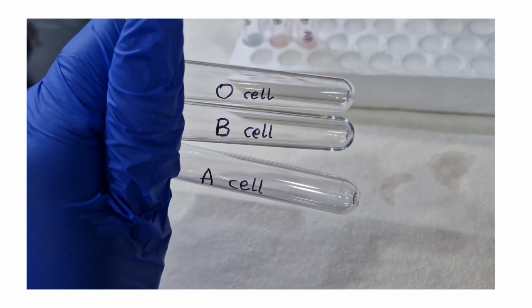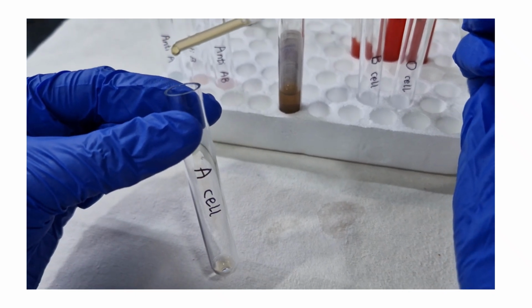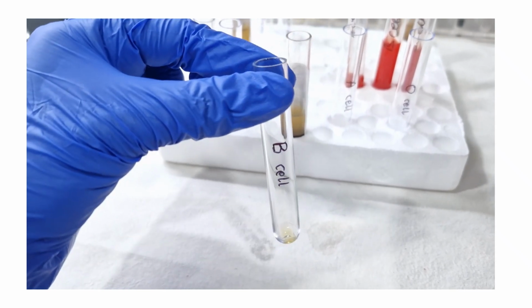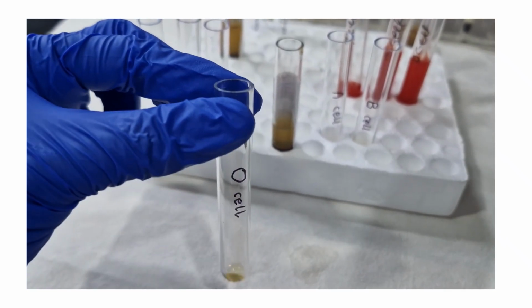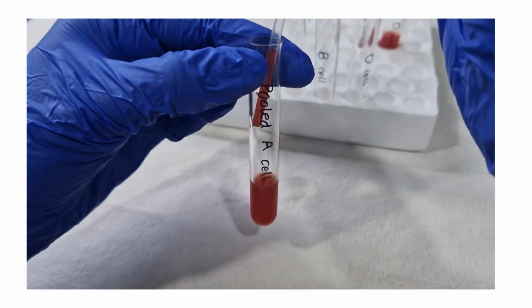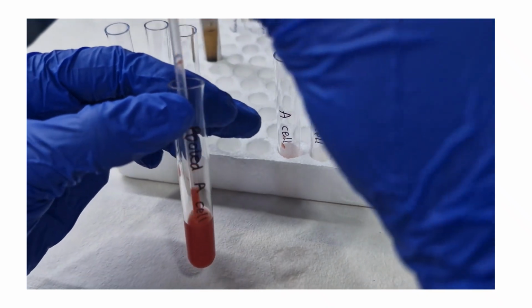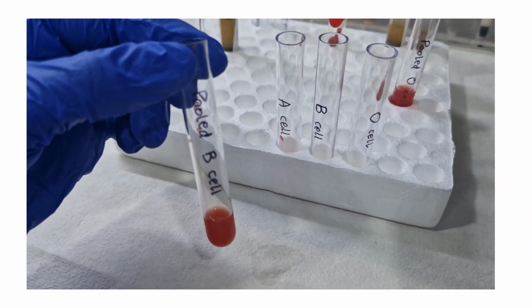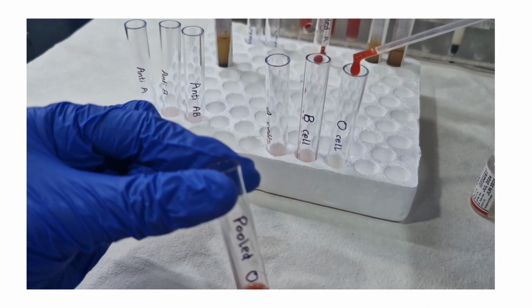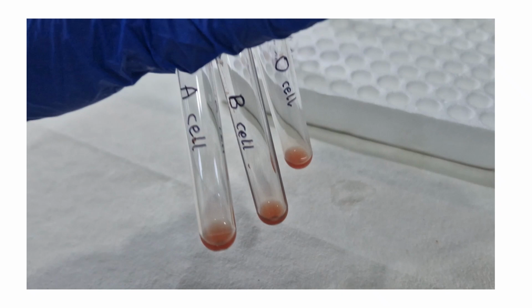Coming to reverse grouping, we have 3 tubes labeled A cell, B cell and O cell. This is the patient's serum. We add 2 drops of patient serum to the 3 tubes labeled A cell, B cell and O cell respectively. These are the pooled A cells, pooled B cells and pooled O cells. We add 1 drop of pooled A cell to the tube labeled A cell, 1 drop of pooled B cell to the tube labeled B cell, and 1 drop of pooled O cell to the corresponding tube. Gently shake the tube to mix the contents thoroughly.